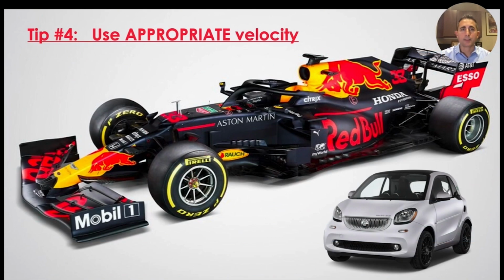So let's go ahead and look at the velocity side of it. Use appropriate velocity for the movements that you need. This is going to come especially in handy when you get to the chairside refinement stages of your cases, because just as you saw there, 4 or 5 aligners is probably not necessary in order to correct that rotation.